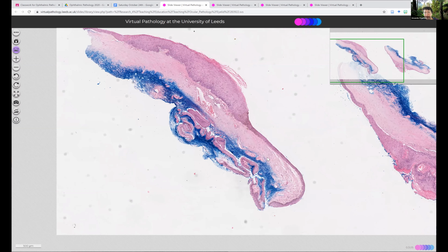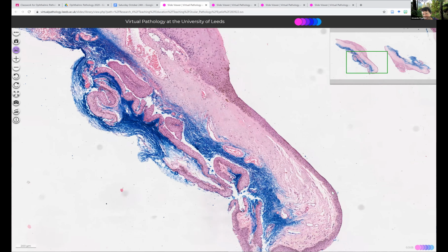That's a good question. The other possibility is it could be conjunctiva that's undergone squamous metaplasia. I would need to find some evidence of that. What's over here? There we go. There could be goblet cells, because I'm looking in the normal-ish stuff to see where I can find any evidence of a goblet cell. Could they be goblet cells? Yes, there's one. What do you think? I think this is conj.